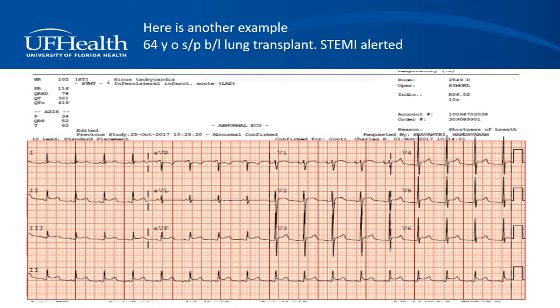This EKG demonstrates the need to understand STEMI criteria. While the computer is often correct, in many cases it is also not. Upon careful review of this EKG, ST elevation is noted on all leads but AVR, in which there is ST depression, which again is much more suggestive of pericarditis.